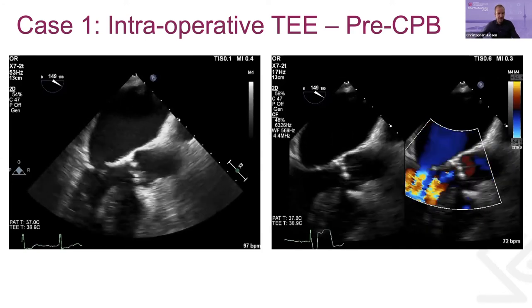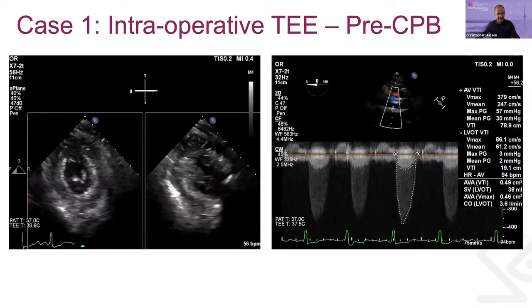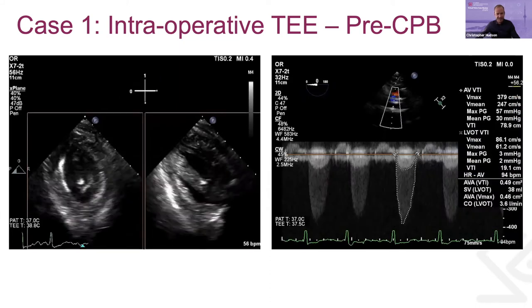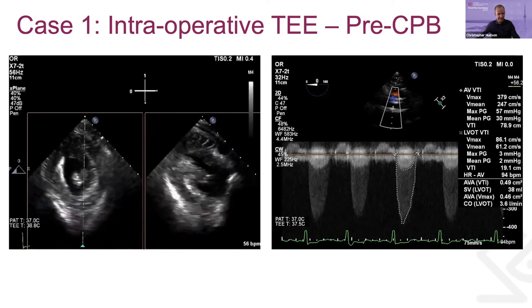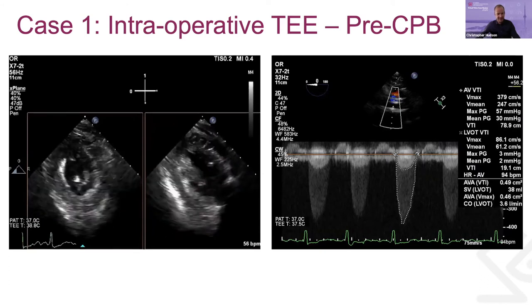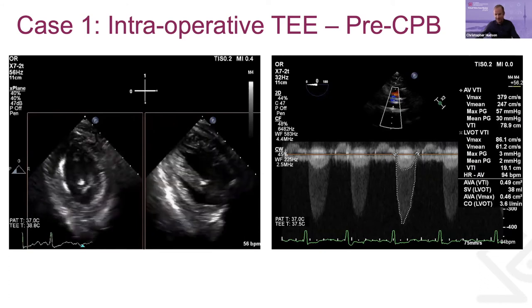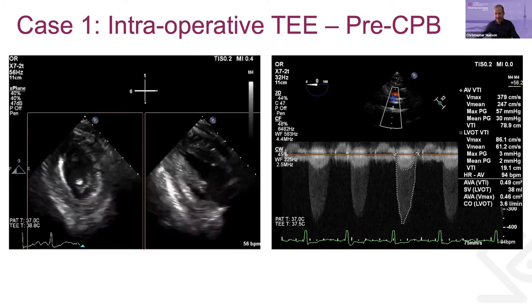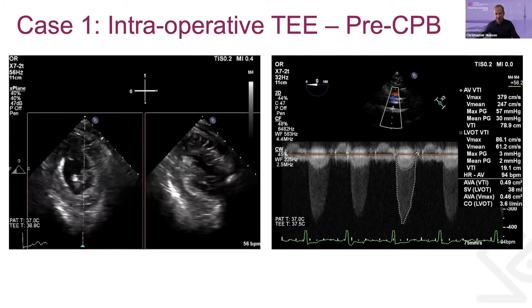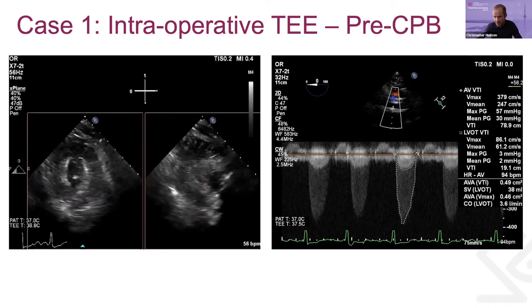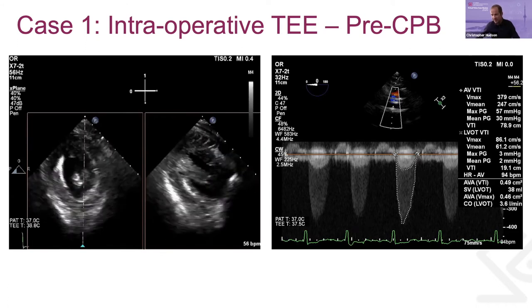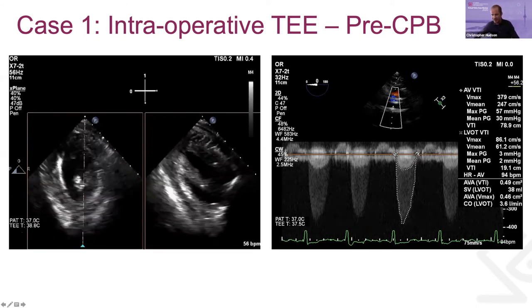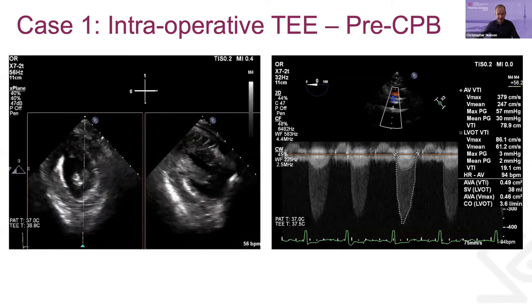Continuing on, on the left-hand side the LV is thickened and contracting nicely — probably a grade 1 LV. If we did diastology on this, we'd probably have at least impaired diastolic dysfunction. On the right-hand side, there's a double envelope continuity equation performed, and we come up with a pretty significant aortic stenosis — around 0.46 centimeters squared.